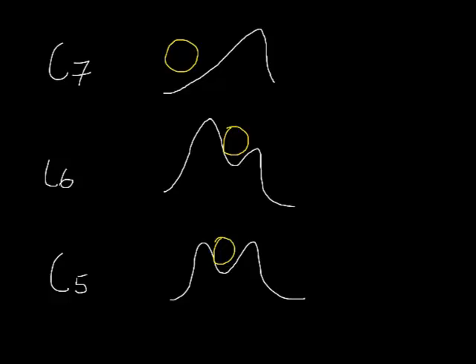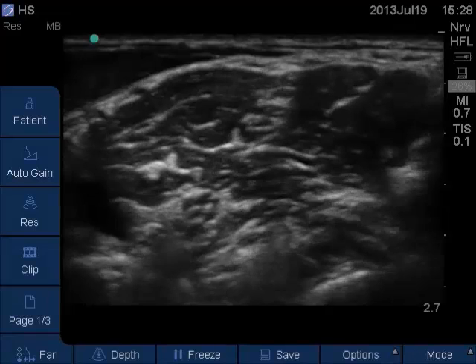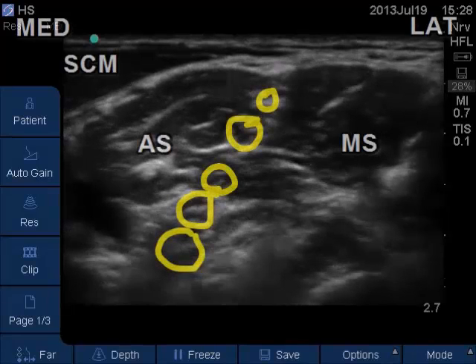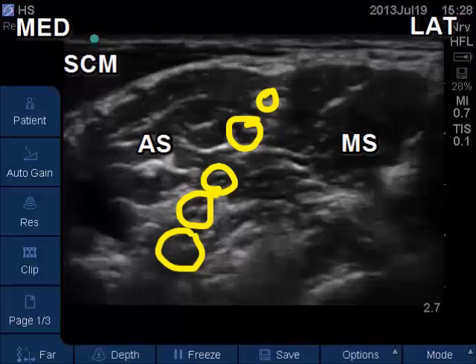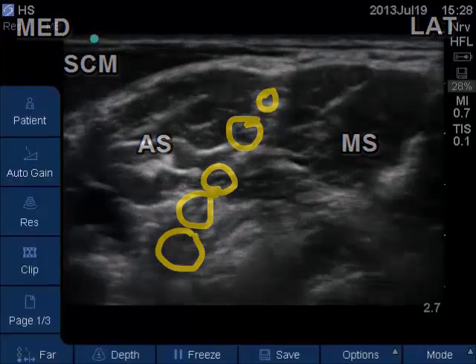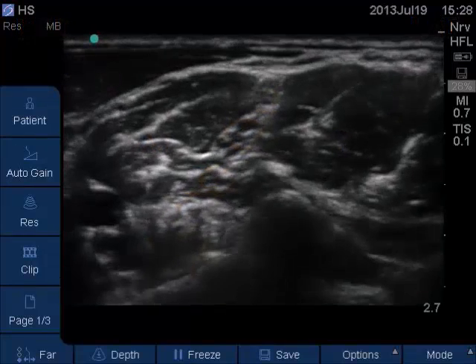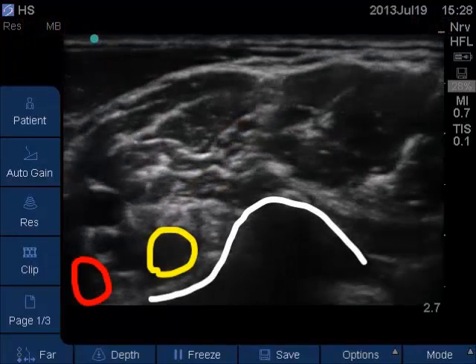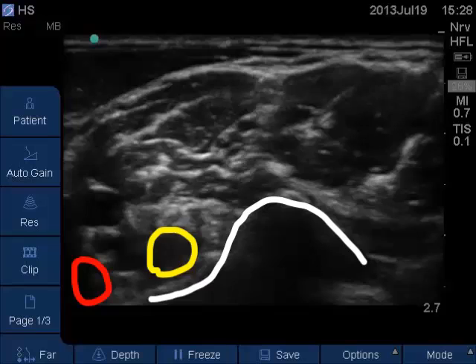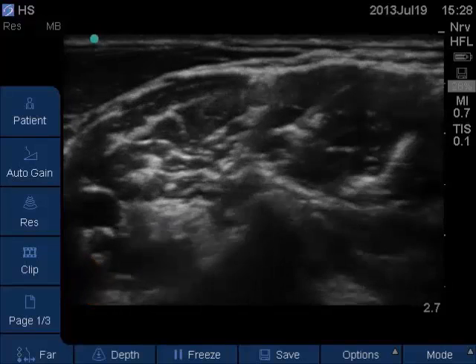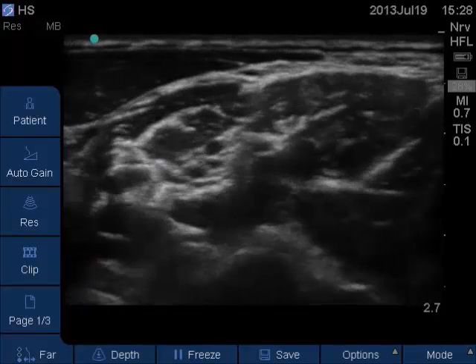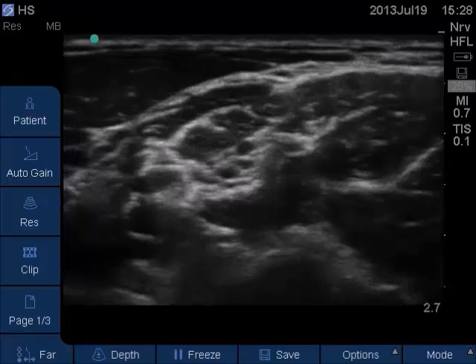Let's now have a look at an ultrasound picture. Here we can see the brachial plexus at the interscalene area, and at this junction we can see the nerve roots lying at the posterior tubercle — and therefore this has to be C7.